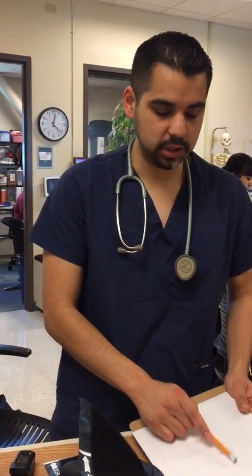And then I'll chart down everything that I did today, that I saw from the patient, his breathing, their vital signs, the sounds of their wheezing, or if they're diminished now, before or after the treatment. And that's pretty much it. Thank you very much, and have a good one.